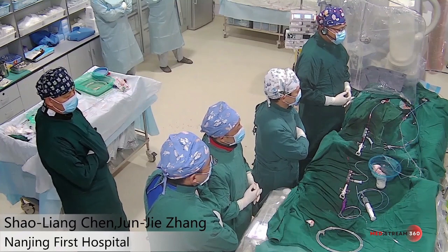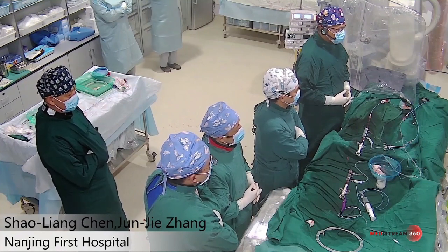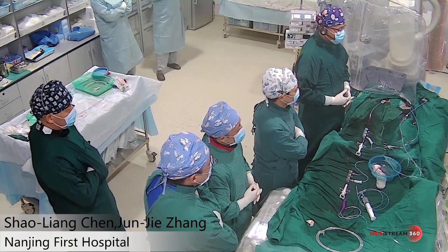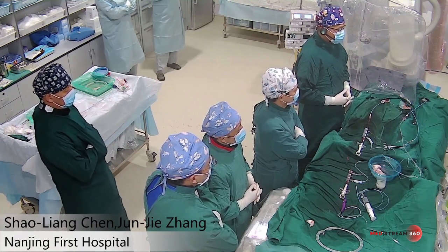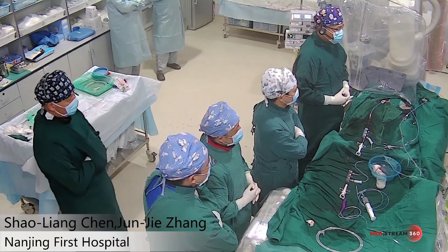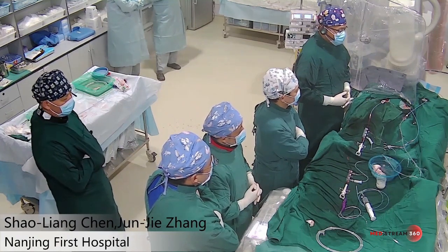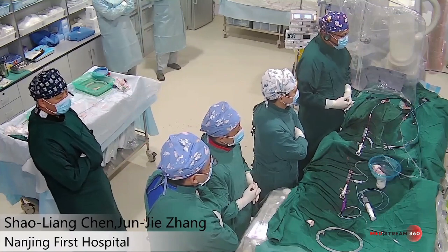Dr. Zhang now is a leader of structural heart disease in my department. So I think this will be a very important case to introduce how to do TAVI, particularly in the scenario in China. So Dr. Zhang, go ahead. Okay, thank you very much, Professor Chen.